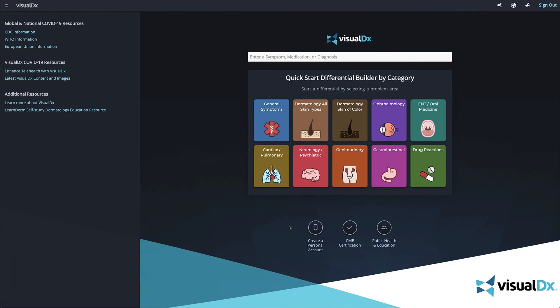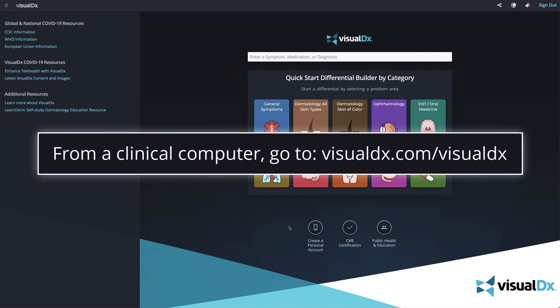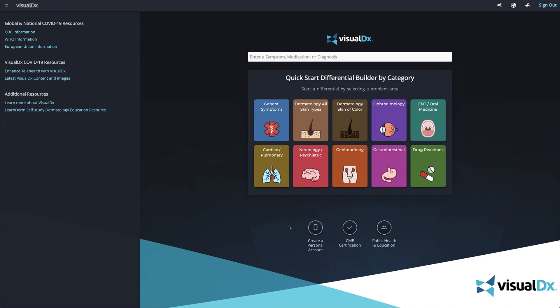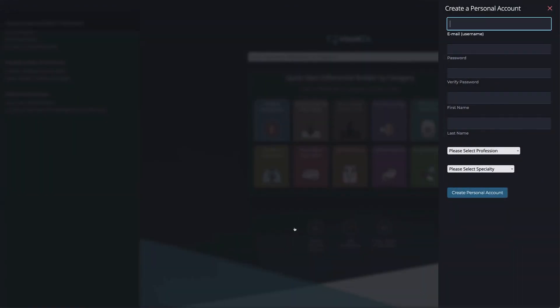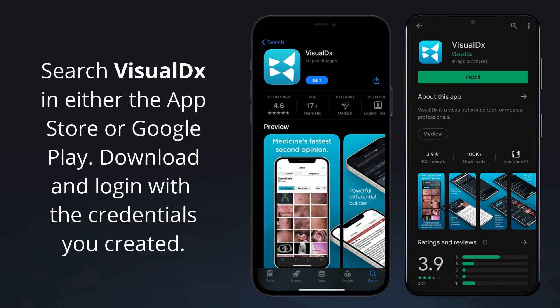Access VisualDX anytime, anywhere by creating your own personal mobile account. From a clinical computer, go to visualdx.com/visualdx and click 'Create a Personal Account.' Fill out the simple form, then download the VisualDX app to your Apple or Android smartphone or tablet. Launch the app, sign in with the credentials you created, and you're ready to go.